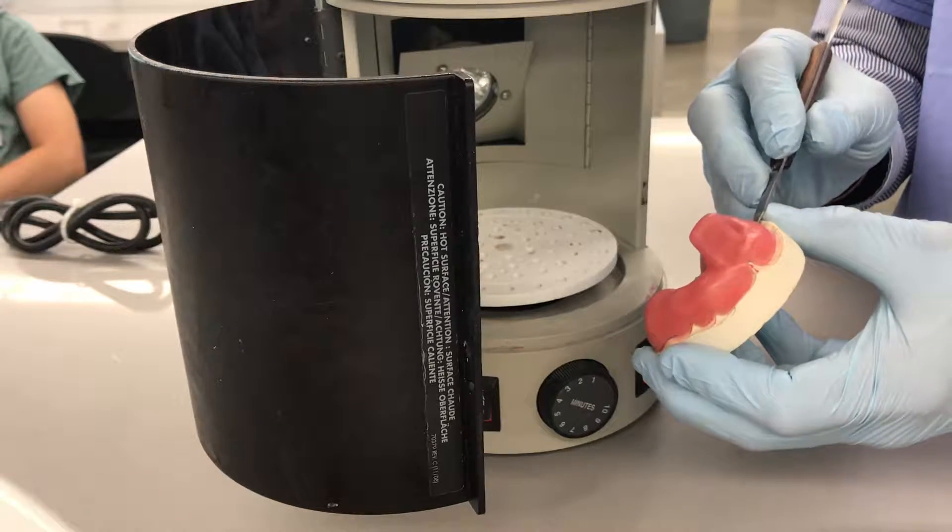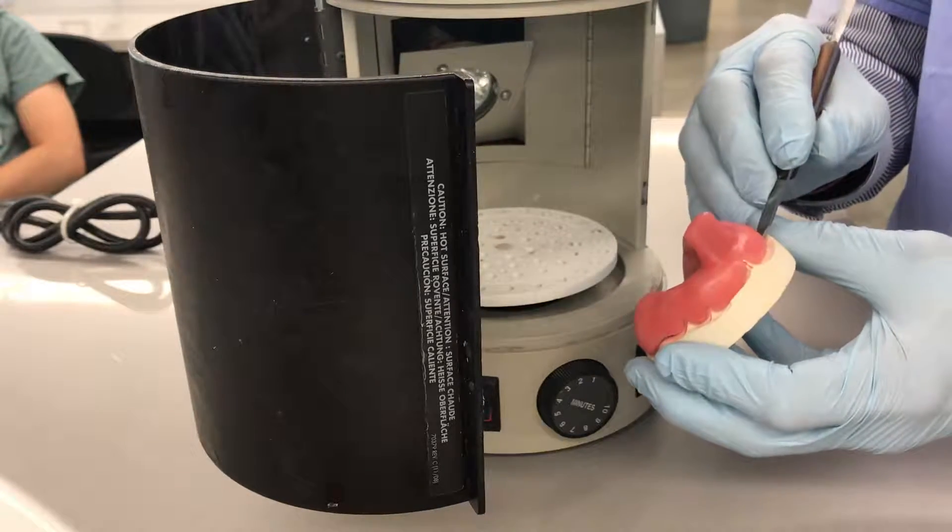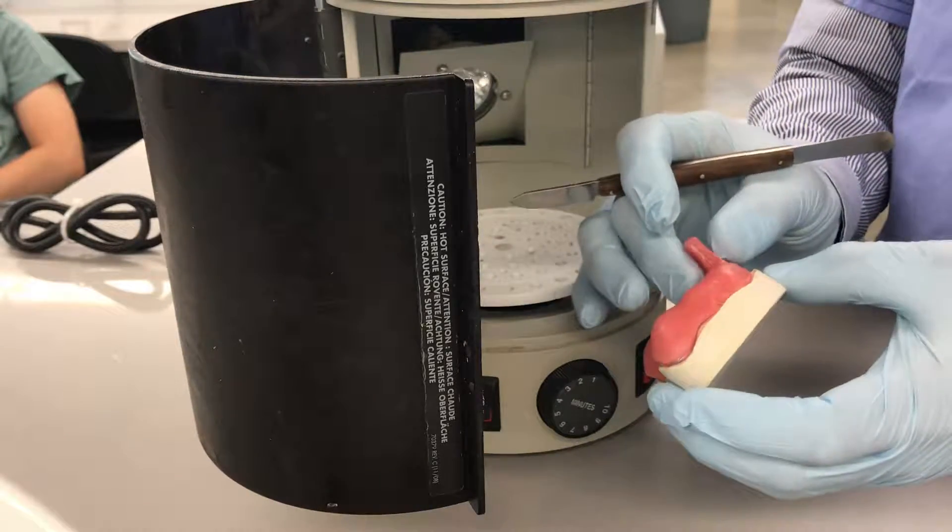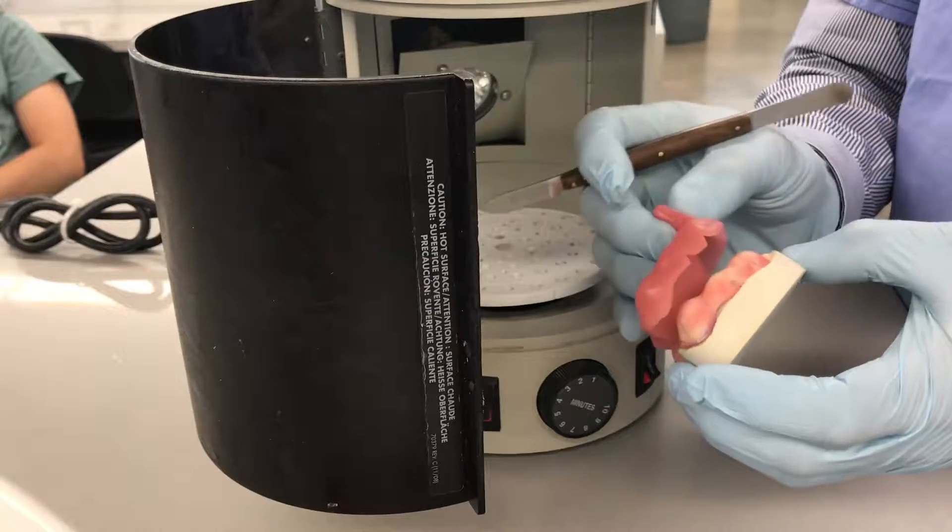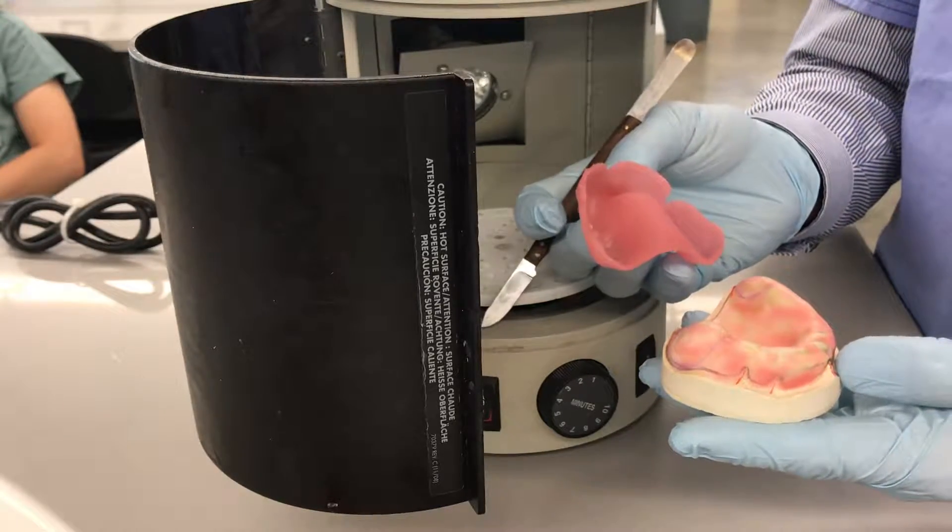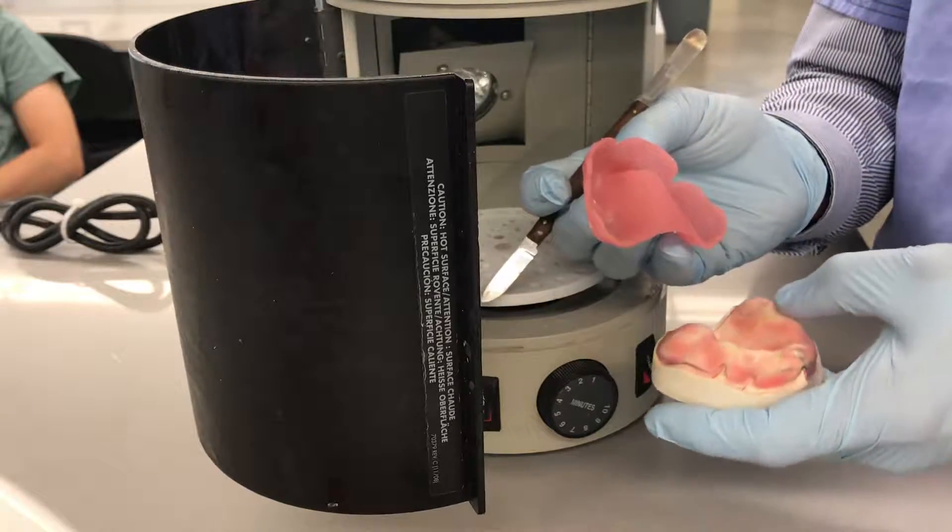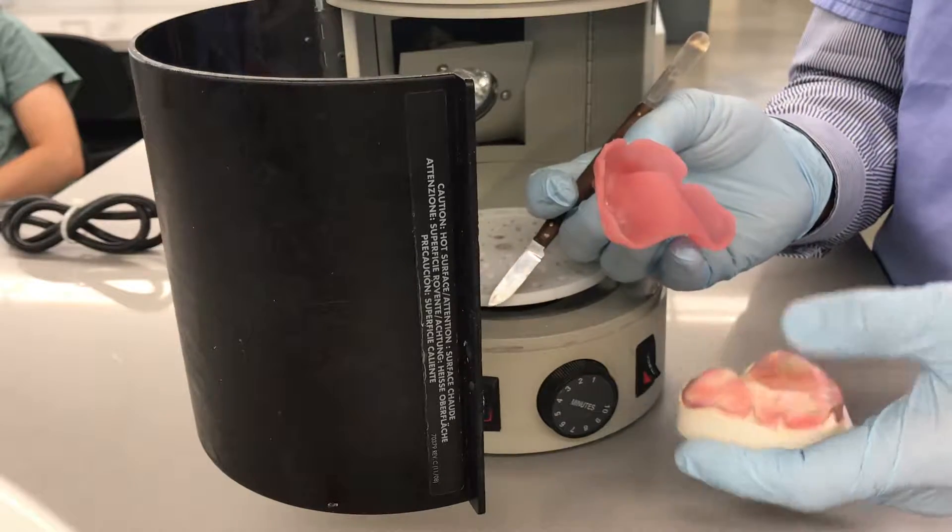I'm going to pry this off the model. If you block this out properly, you shouldn't have any undercuts. It should come off rather easily, very clean, because I took care in smoothing out the wax that I used for my block out.